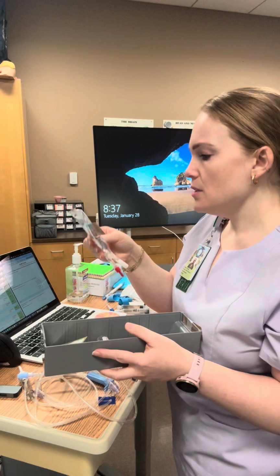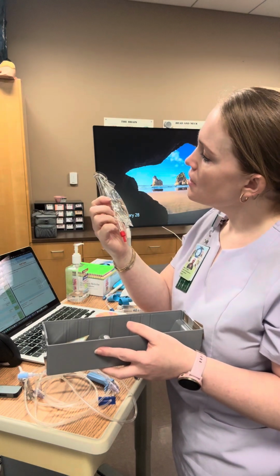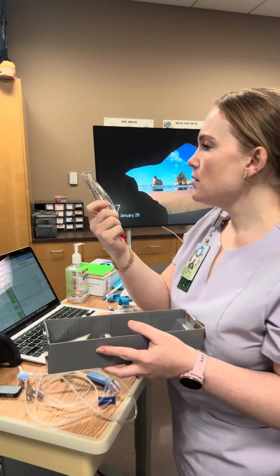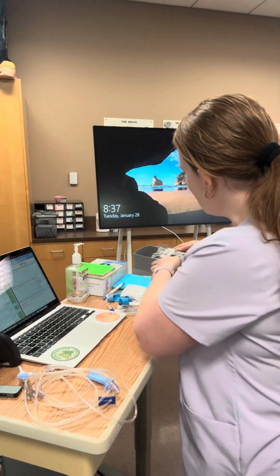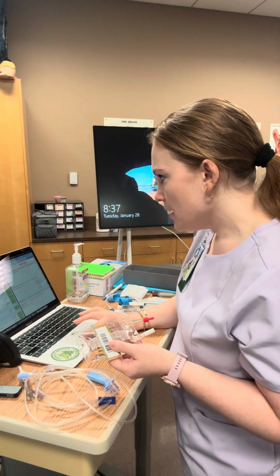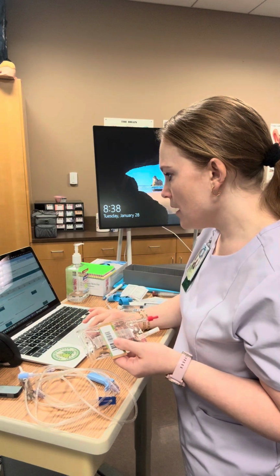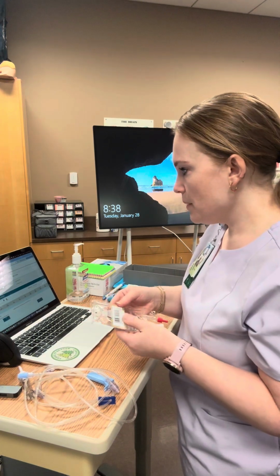And the last thing I'm going to do is I'm going to check for the expiration date on my packaging here, which is 11/27. And while I'm looking at the expiration date, I'm checking to see if there's any leaking or any particles, anything wrong with the bag itself, and it looks great. So I am good with the pulling of my medication. So I can put down my orders since I am done with that for now, and I'm going to enlarge my MAR. And I'm going to come on right to MedCheck 2.